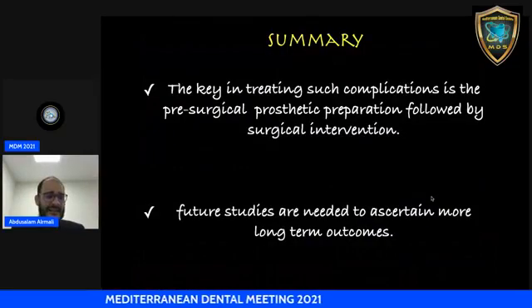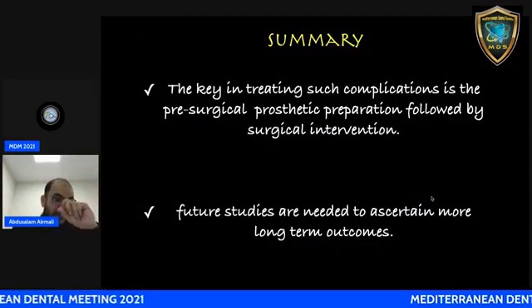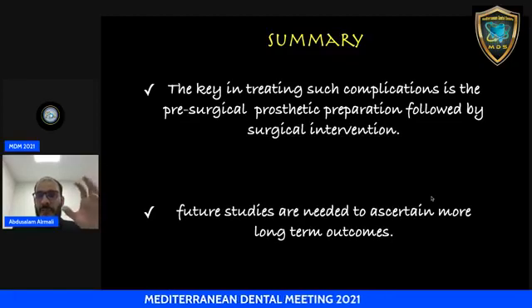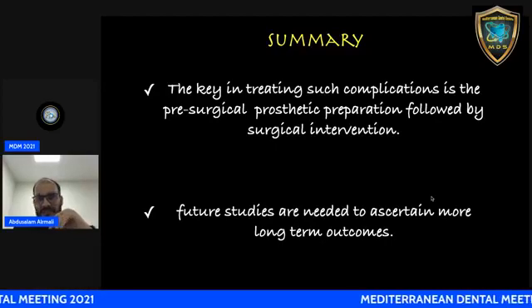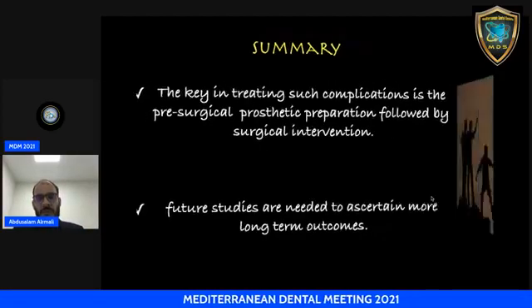And finally, let's summarize with a take home message. I think with a prosthetic surgical approach, actually we can solve most of those complications of aesthetically failing implants, and future studies are needed to compare and ascertain the long-term outcomes.